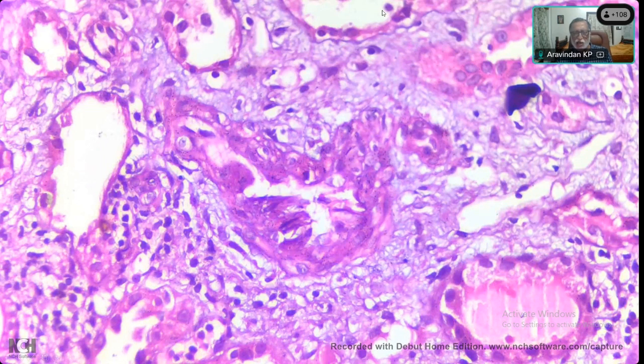See, look at this. This is edematous, indicating some acute process, and some inflammation in the interstitium, some edema. The tubules seem to be separated by edema fluid rather than fibrosis. So all is not lost as yet because this may recover sometimes. You cannot write them off actually.